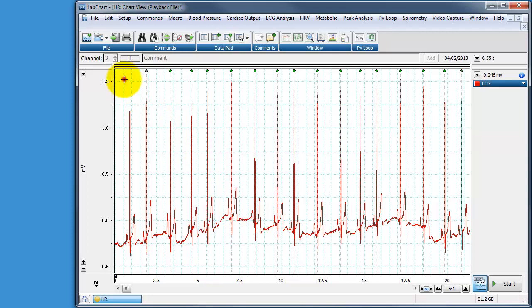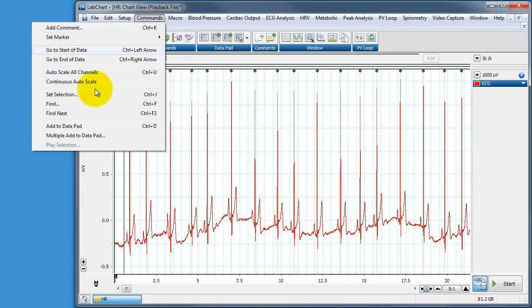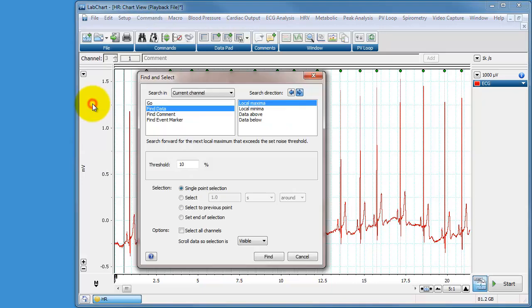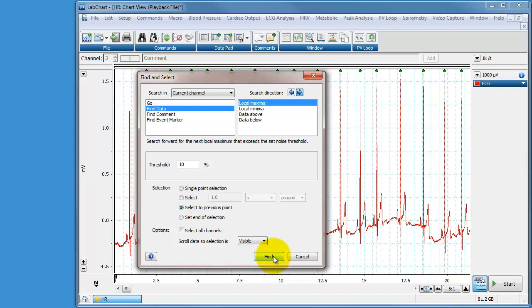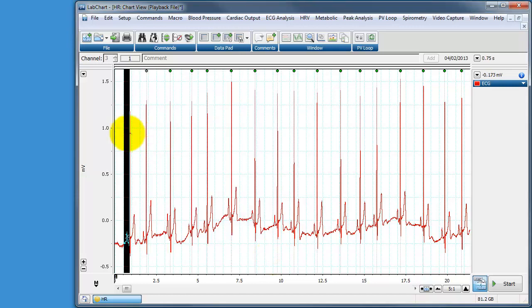So let's go back to the start again and this time we can go back to the find section and we can choose a different option down the bottom here. Before we just chose a single point. Now we can select to the previous point. In other words it will select the distance from where it's just been to where it has now gone to.